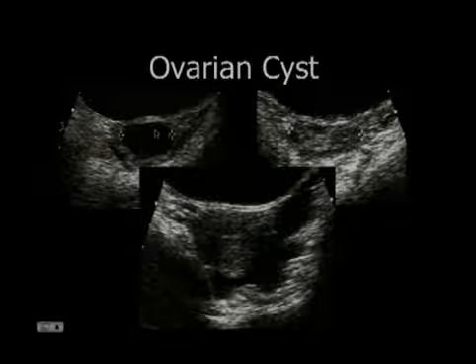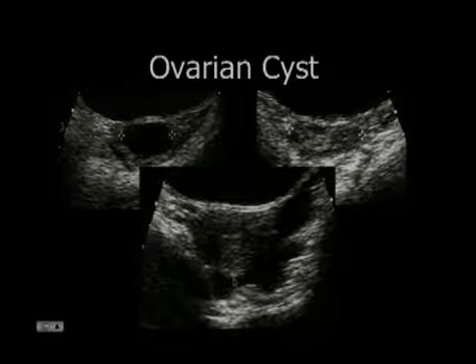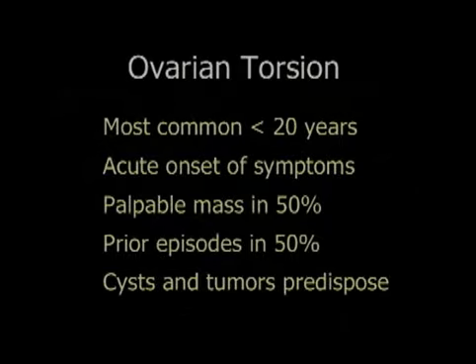So even though it's a small cyst, certainly cyst rupture can cause a very large amount of fluid, probably from the cyst and some subsequent hemorrhage. So look for that. These are the most common causes of pain. The thing that the emergency department is usually most worried about is ovarian torsion. And these are most common in the younger child, around puberty and young adulthood.